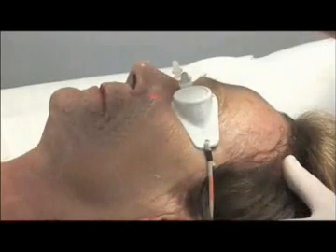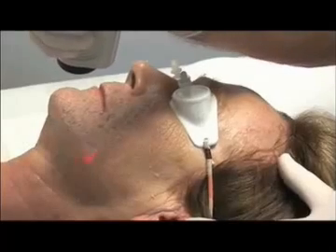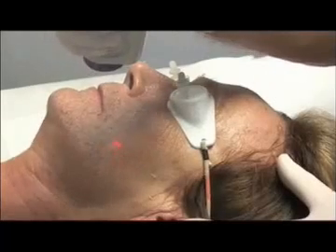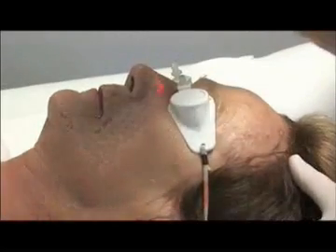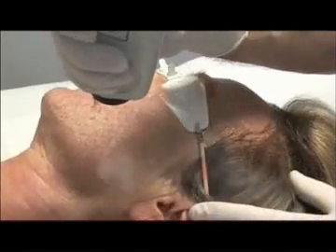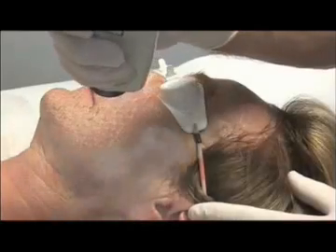Alors, laisse souffler un peu. I'll let you rest for a while, especially in median parts. It's often more painful here than on lateral parts. We will cover the whole cutaneous surface of the face in small successive squares. Toujours pareil, on déborde pas. And again, we must not go beyond the bony ridge.